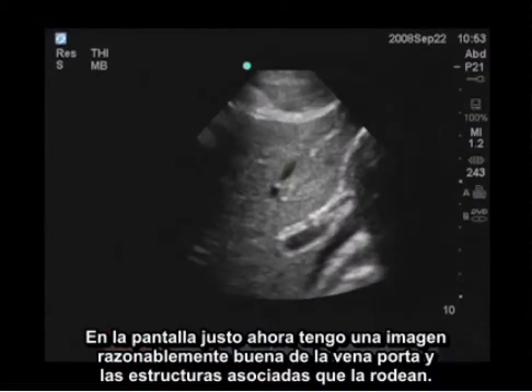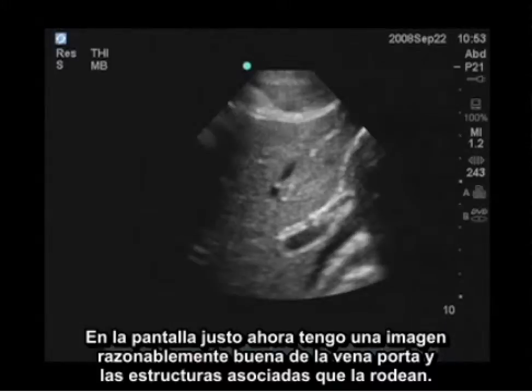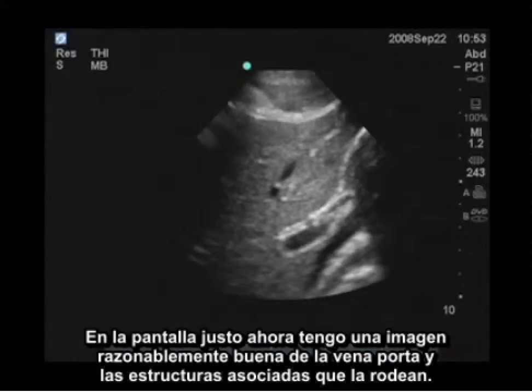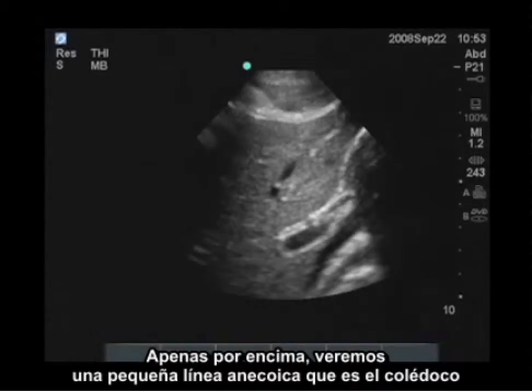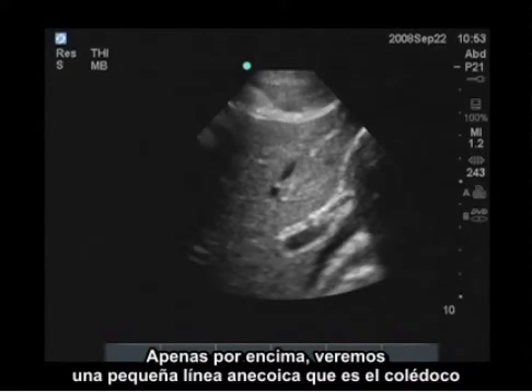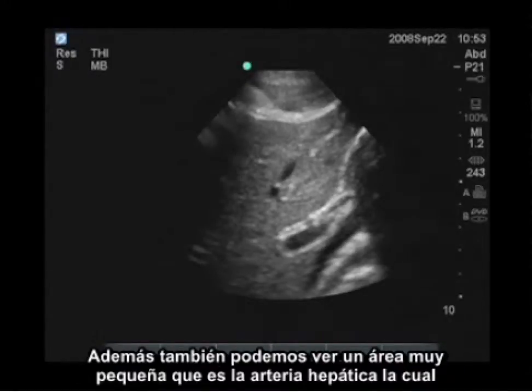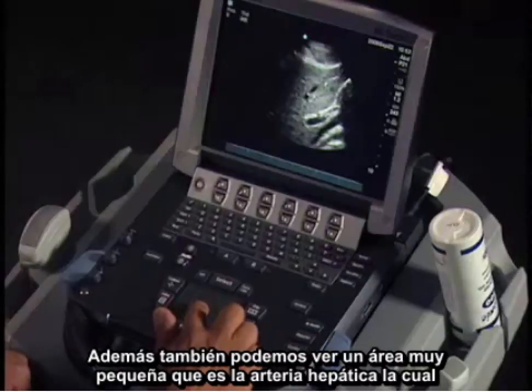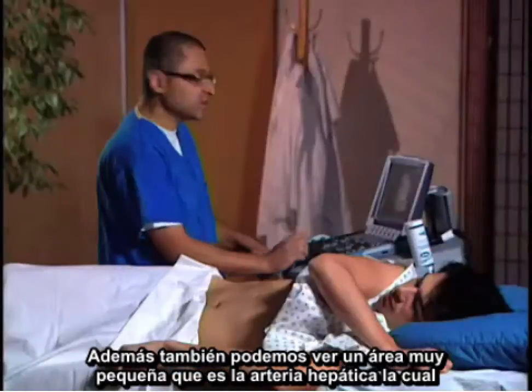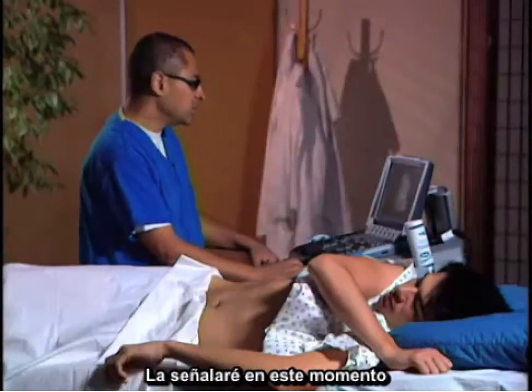On the screen right now, I have a reasonably good image of the portal vein and the associated structures around it. Right above it, we see a very tiny anechoic stripe — that is the bile duct. In addition, we also note a very small area which is the hepatic artery, which I'll point out in a moment.